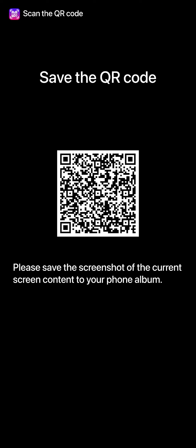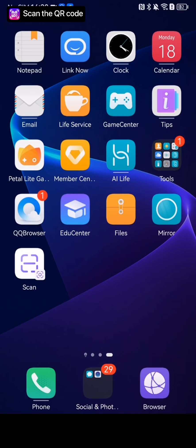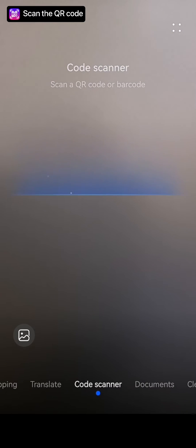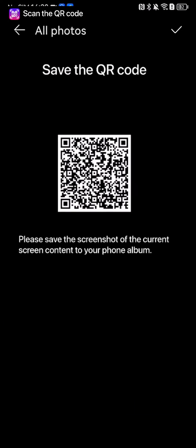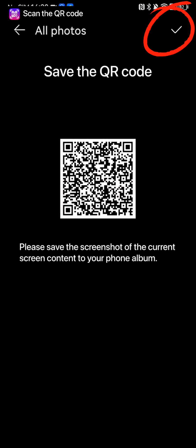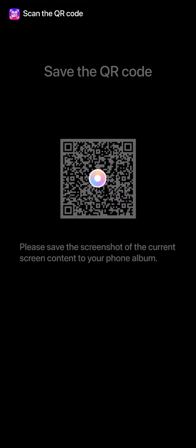If you cannot download it through the App Store, please save the screenshot of the current screen content to your phone album. Then open the camera for QR code scanning, open the system album, and select the screenshot of the QR code you just saved to scan. Click on the link identified by the camera to jump to the web page.